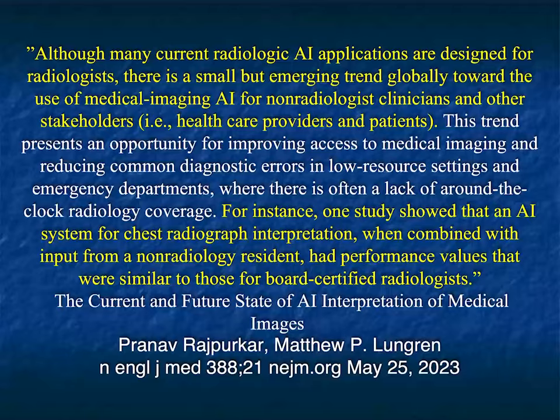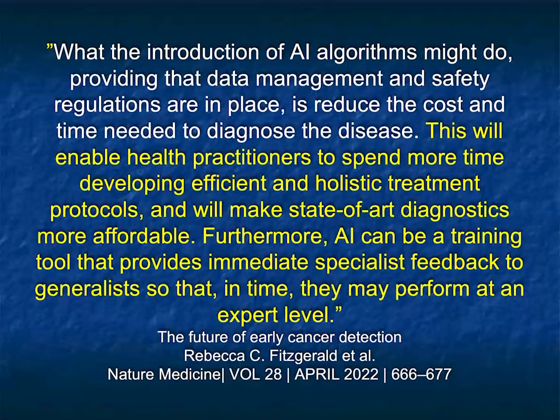Rajapur makes the point, although many current radiologic AI applications are designed for radiologists, there's a small but emerging trend globally toward the use of medical imaging AI for non-radiologist clinicians as well. So not only are we going to be using AI, but the surgeons, the GI folks, the internists, everyone's going to be using AI. And the combination of AI and liquid biopsy, how we work is all going to change. How pathology and radiology work together, they're going to have to work even closer together.